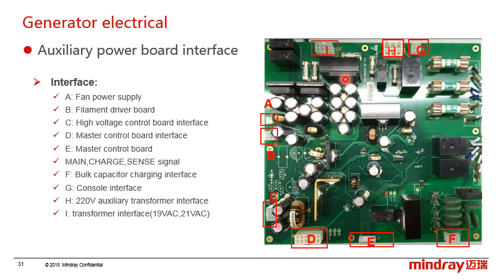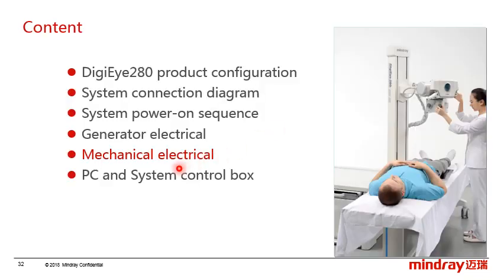And this is the picture of the auxiliary power board. And we can see the connector definitions here, and you can learn them by yourself. The next part is the mechanical electrical.